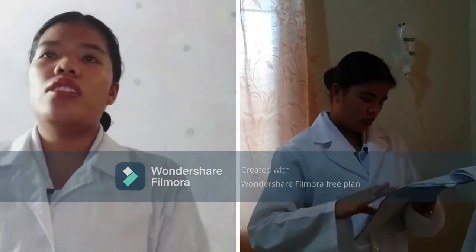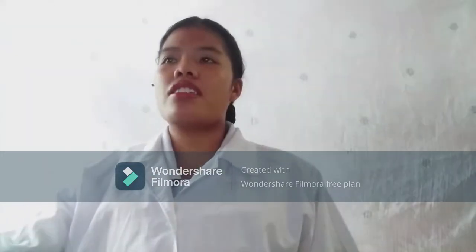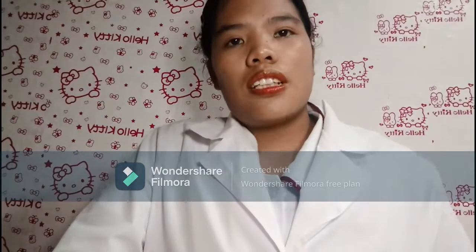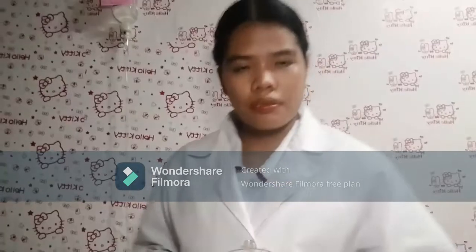First is to check the doctor's order and make an IV label. Next is wash hands. This prevents the spread of microorganisms. Then gather all the equipment and prepare the IV solution and tubing. Having all equipment available saves time.